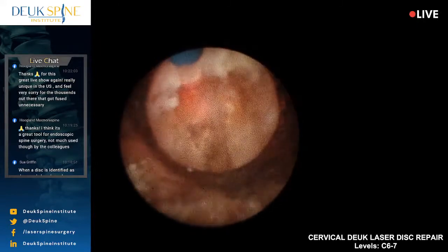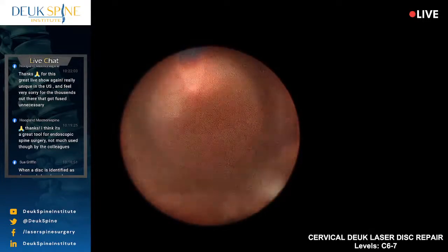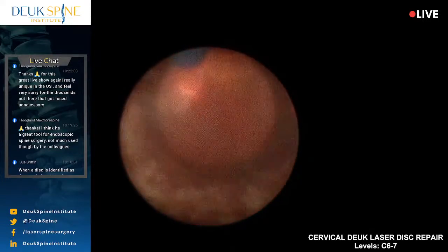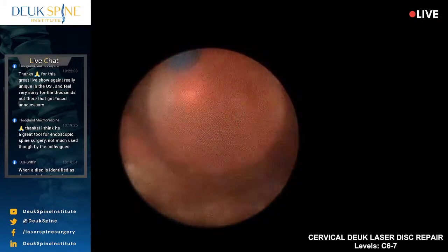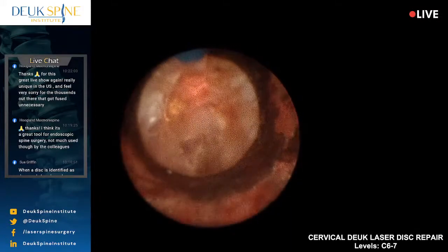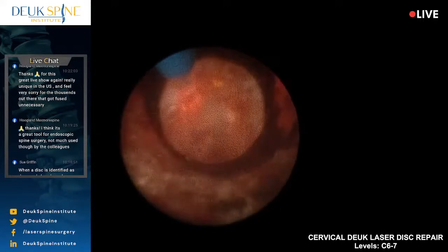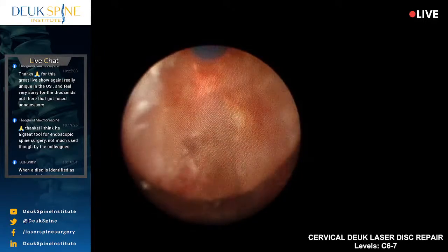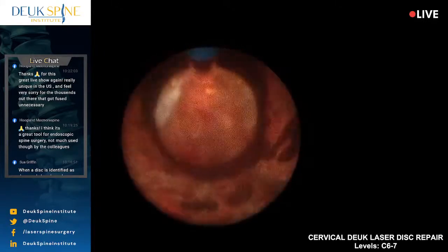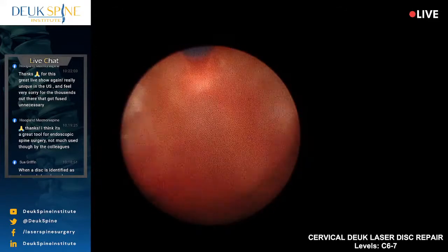Let's see. So I'm doing a technique here where I'm actually pulling backwards with the tube, going back into the disc, deeper into the disc, away from the herniation and the nerve root. And then once I open it up to the side here, like I'm doing now, then I'll come back in and remove all this stuff pushing on the nerve.